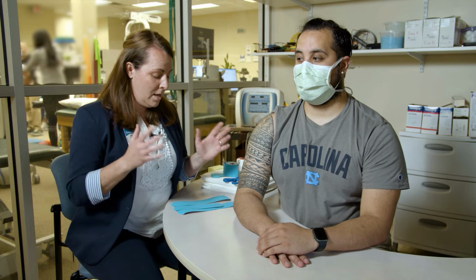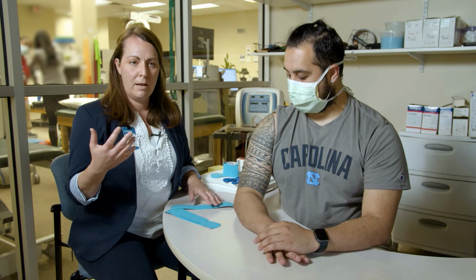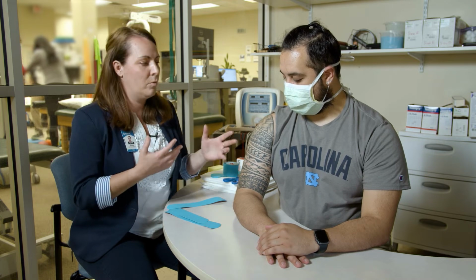I'm going to show you a type of taping here that can be helpful for shoulder pain. Typically we have 2 to 3 strips that we use for taping. Sometimes there's more. It depends on the body part and what you're using it for.